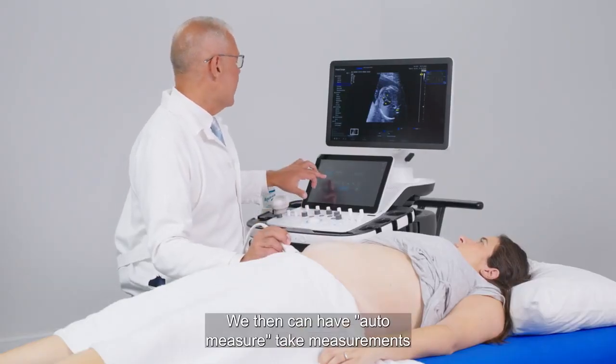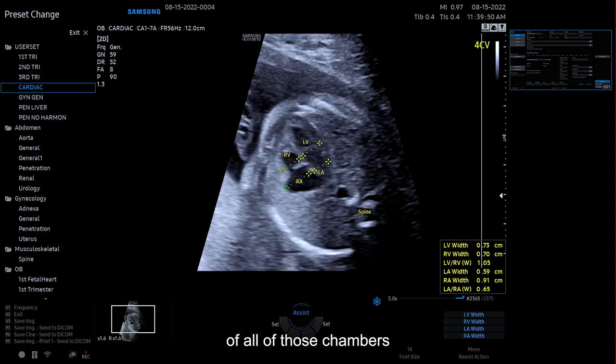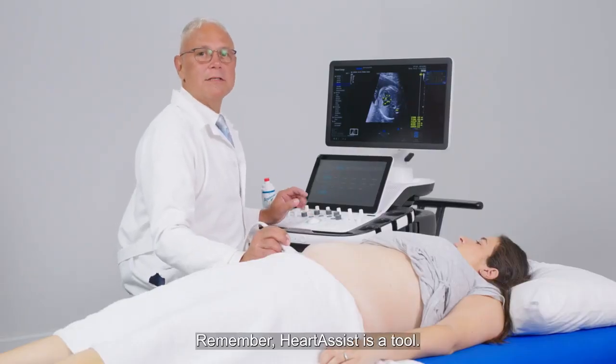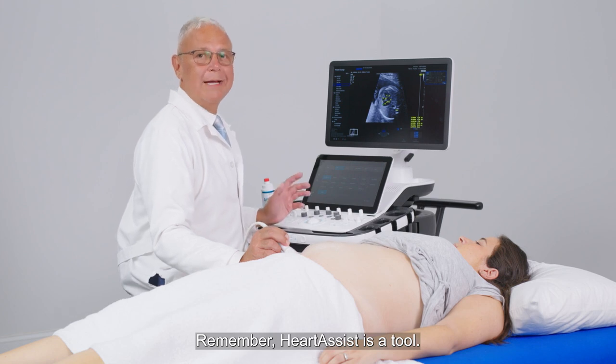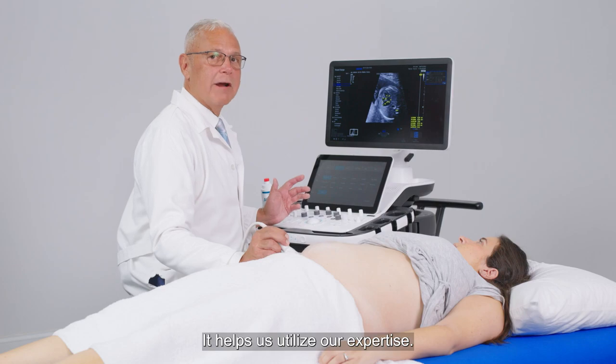We then can have auto measure take measurements of all of those chambers, and we can tweak the measurements if we're not happy with them. Remember, HeartAssist is a tool. It is not a replacement for us. It helps us utilize our expertise.